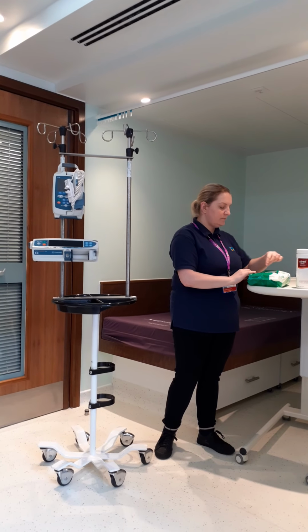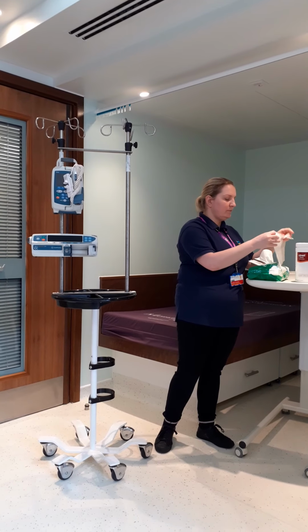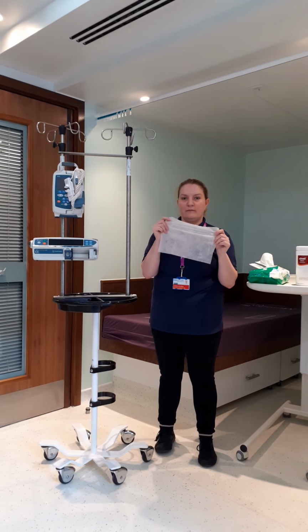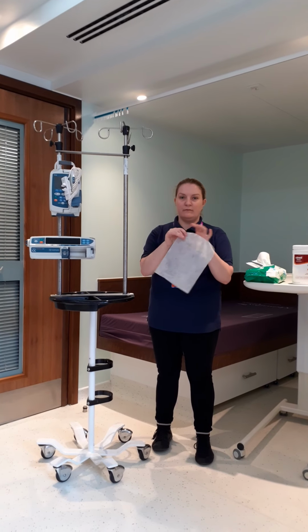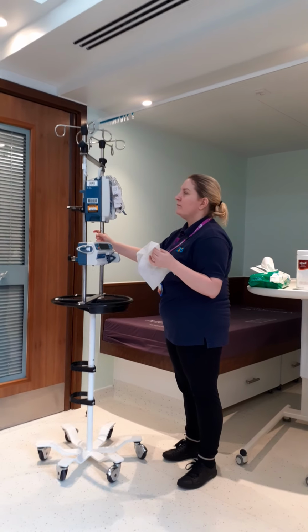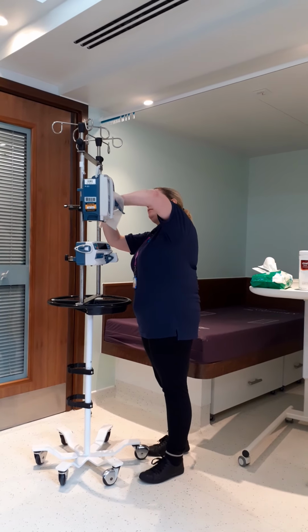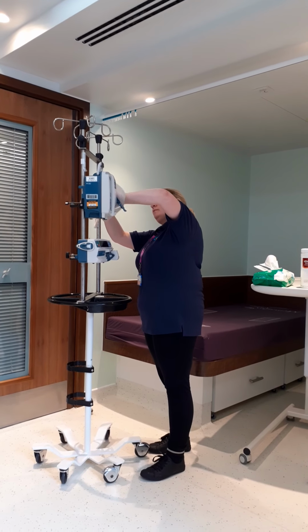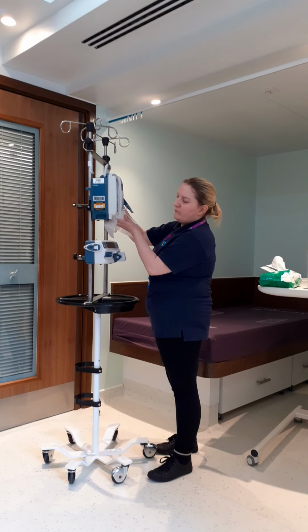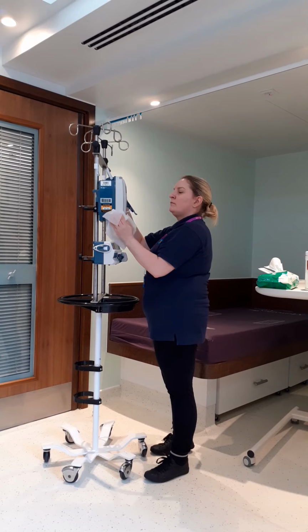Now we're going to go on to step 2, which is to take out a single wipe and fully open it out. It's important to fully open it out so that you'll be able to distribute the cleaning agent evenly across the surface. The first thing we're going to think about is, are there any specific sites of contamination that we can see? Are there any specific dirty parts? If there are, spot clean these first before going on to the other steps.